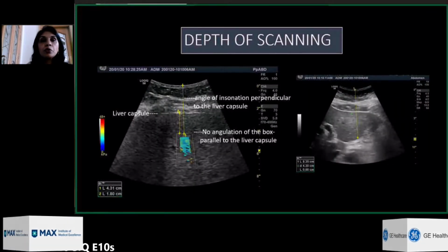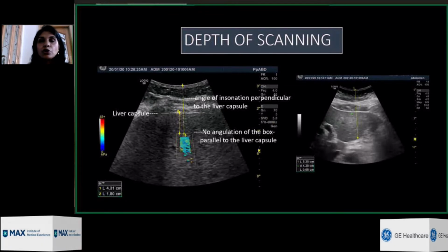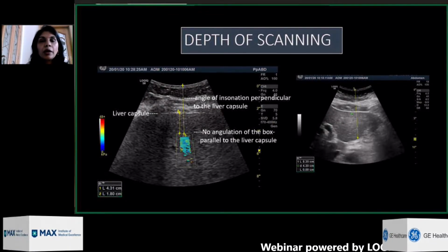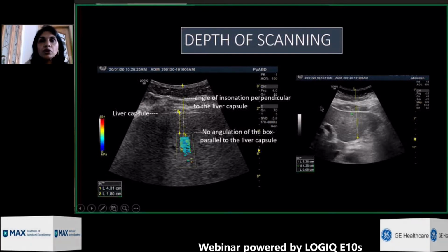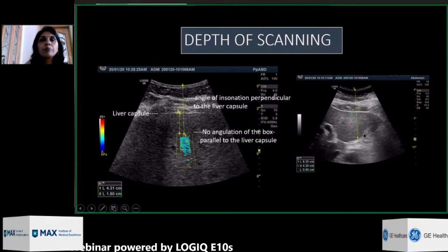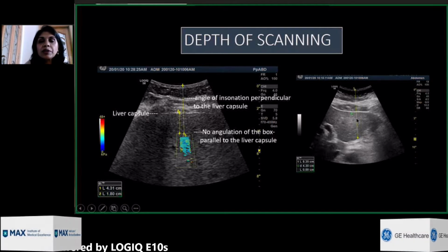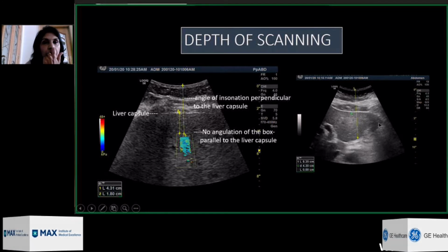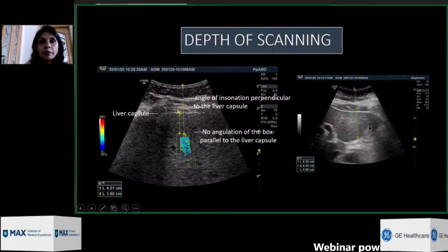So here we were talking about some of the tricks and tips, how you can have a great study. As you can see here in the image, the left lobe of the liver cannot be used as the elastography box or study. Why? Because there's an insufficient thickness for putting the Q box. Also, the cardiac pulsations do interfere with good quality imaging.